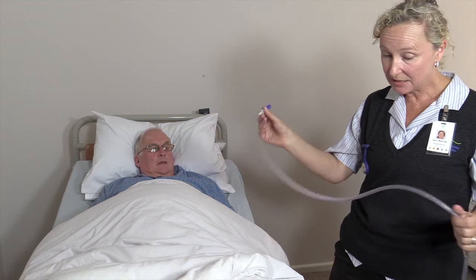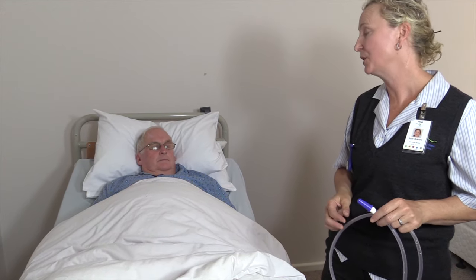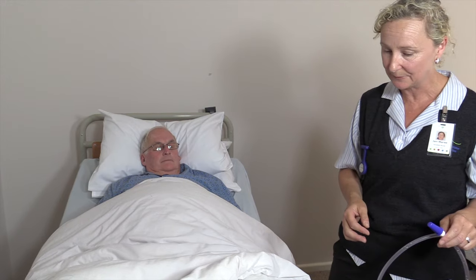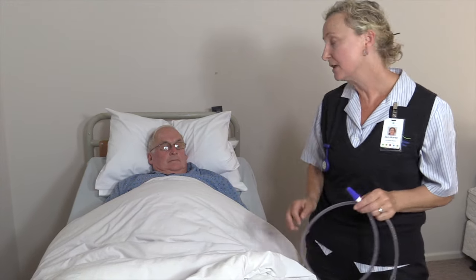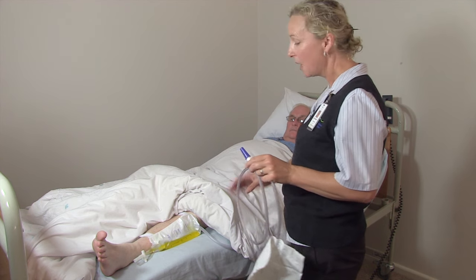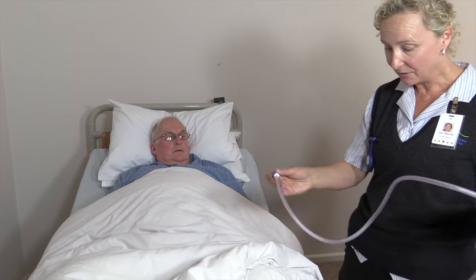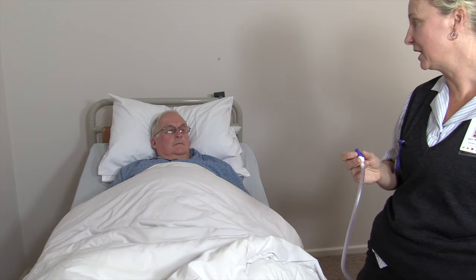What we're going to talk about is adding the night bag on for overnight so that you're not having to get up during the night. The day bag is very useful for emptying yourself when you're able to, or for shorter periods so you can empty it frequently. Overnight, this will save you from having to get up.